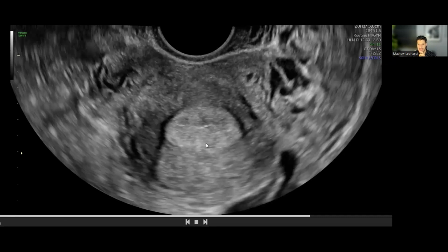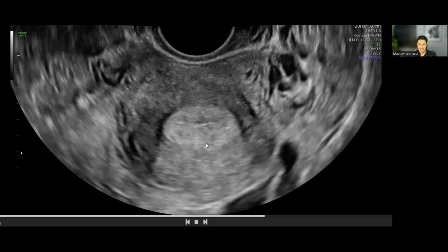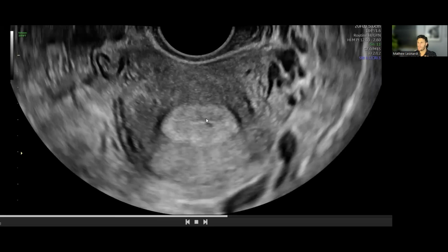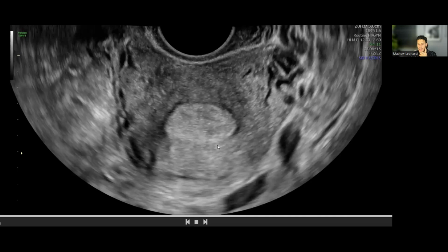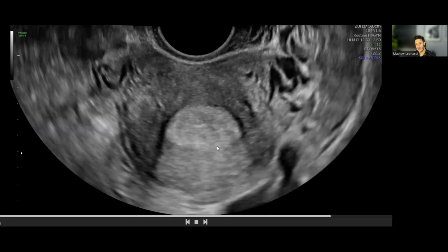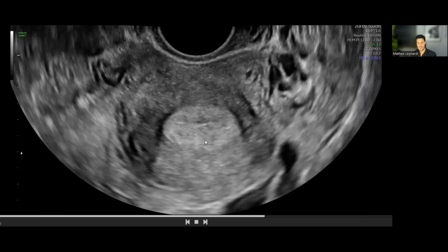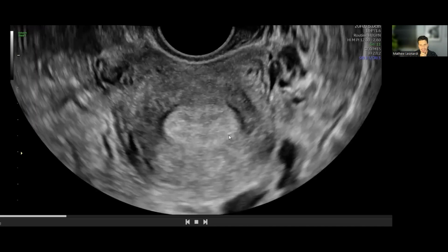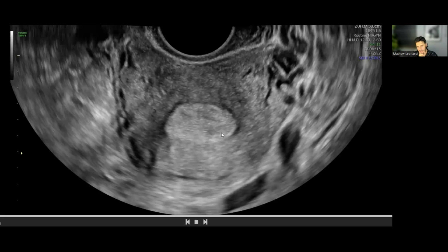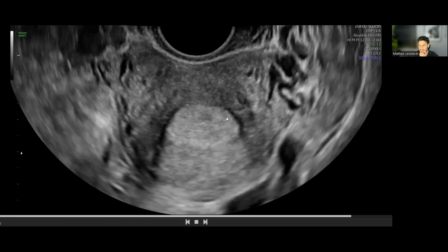Okay, so here my sonographer is very technically skilled in performing what we're calling an endometrium or polyp sliding sign, where we're applying pressure to the uterus, and by extension, that pressure is applied to the content within the cavity to try and reveal sliding between the structures in the cavity. We're definitely seeing a difference in the movement of the structures posteriorly and anteriorly, but in transverse, I'm not seeing quite a lot of sliding per se.